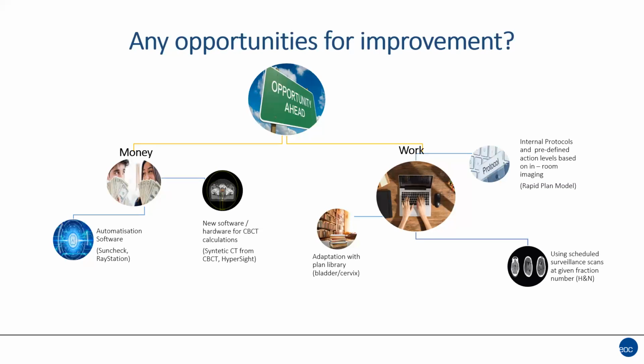And the third thing, and I need to say I don't know which hospitals are doing this in practice, but in papers you can also find that there could be scheduled surveillance scans at any given point of the treatment. So sometimes you can do routine rescans. Let's say for a treatment site like head and neck, you have routine rescans after maybe a week, maybe halfway through treatment, but at a fixed point. So it's not a question of whether we do it or not, it's scheduled.